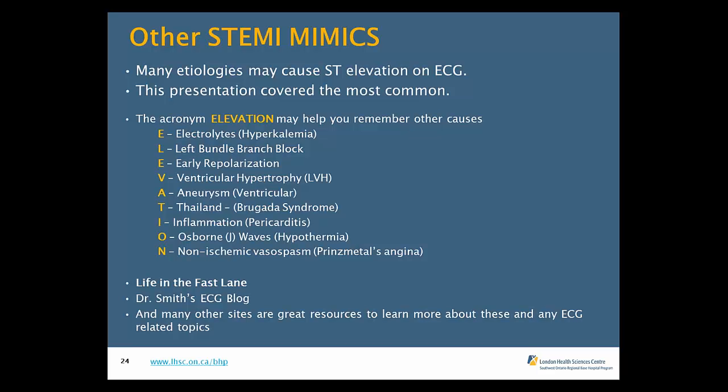It's got a huge ECG library with tons of ECGs that you can look at, but it also describes in a very straightforward, succinct fashion what to look for, what these changes are, and what the criteria are. So it's a great resource, one that I often use to pull out teaching ECGs from, as well as helping prepare for lectures to medical students, to our residents, and for our paramedics. It's a great resource, and it definitely has a seal of approval from my end. If you are familiar with it, then I'm sure you'd probably agree, and if you aren't, it would be one to take a look at.